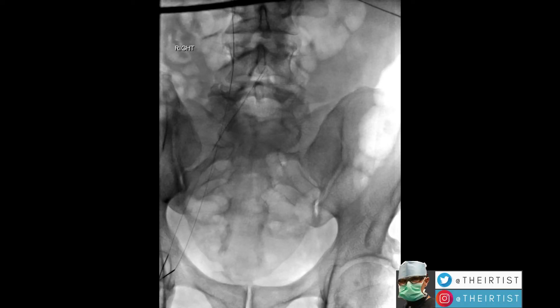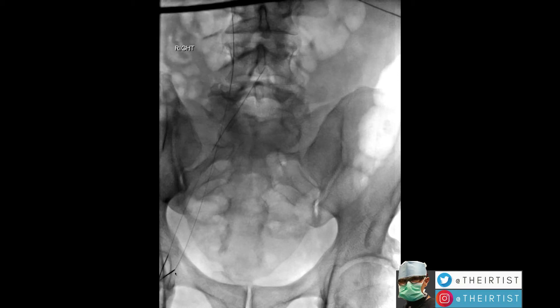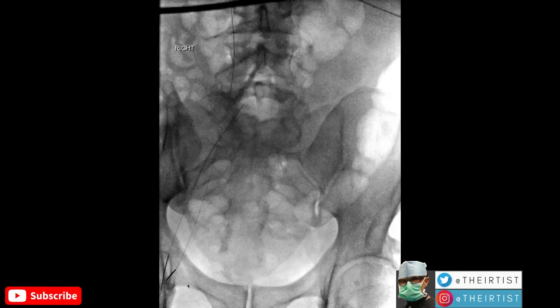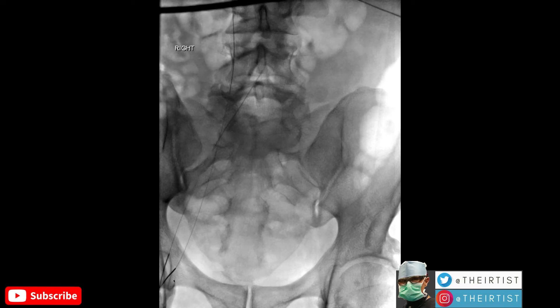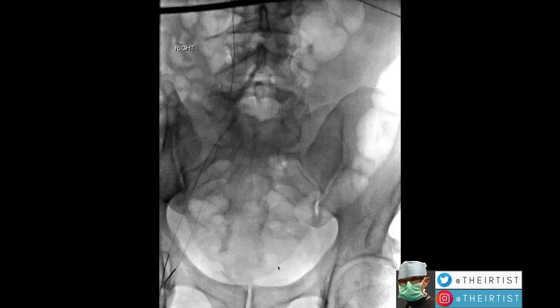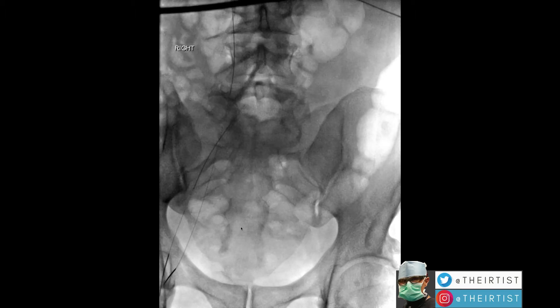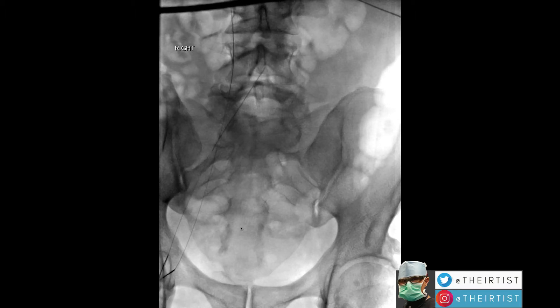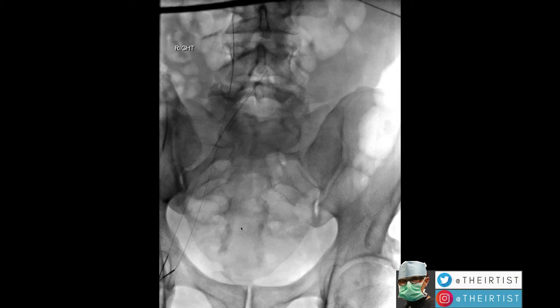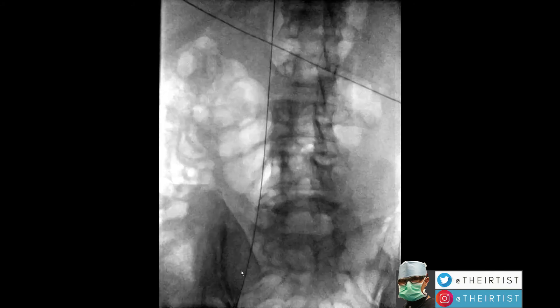I will talk you through the embolization procedure. This is how we access — a small needle stick done under local anesthesia. We get access to the patient's vein in the groin. This is a view on fluoroscopy, the x-ray table over which we do so. Thanks to the x-ray imaging, we are able to see the whole body. There's no need to do surgery, and this is the main difference between interventional radiology and surgery.